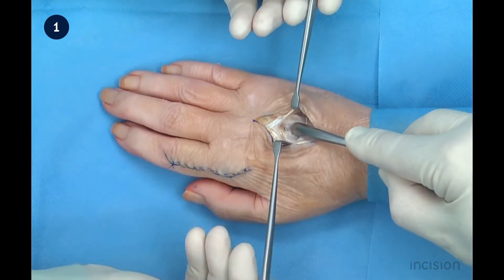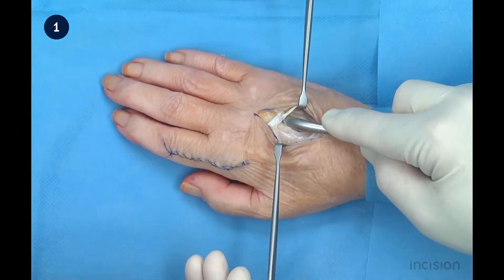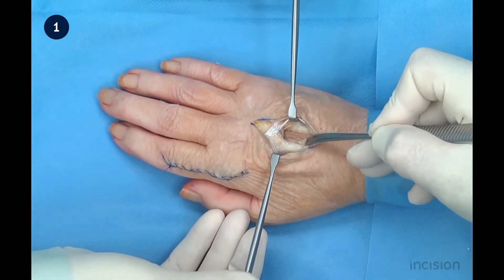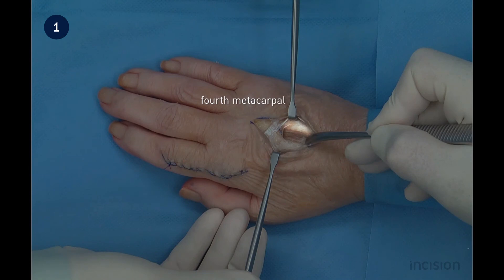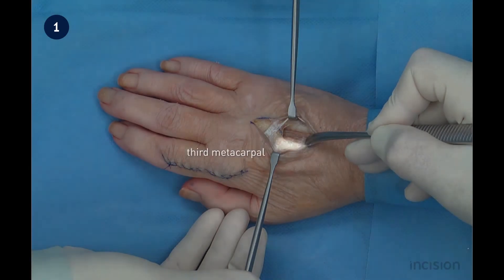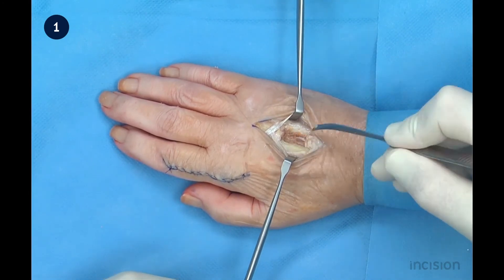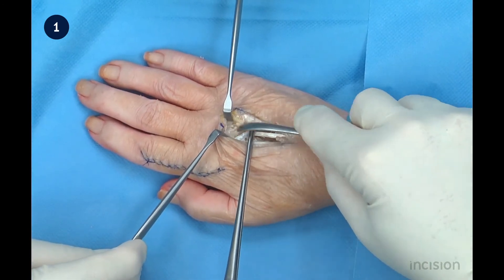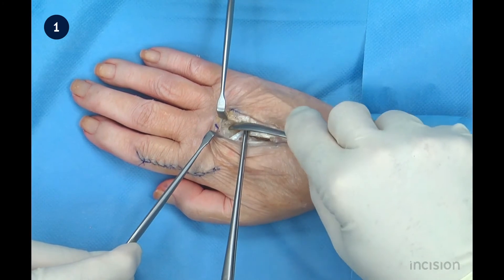The periosteum overlying the bone is then incised. The periosteum is then lifted using a periosteal elevator off the surface of the fourth metacarpal bone and third metacarpal bone. This image shows the exposed fourth and third metacarpal bones. Note that the resection of the periosteum can extend proximally toward the carpometacarpal joint or distally toward the metacarpophalangeal joint, depending on the desired extent of bone exposure.